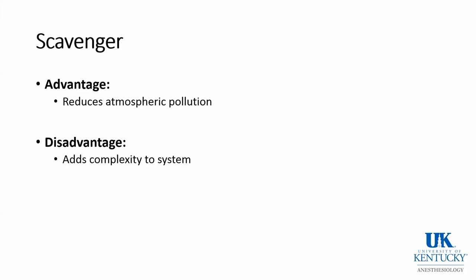I'm not going to discuss the risks of chronic exposure to atmospheric pollutants. However, it's pretty obvious that no one wants to be exposed to anesthetic agents and or nitrous oxide on a chronic basis. So the main advantage of a scavenger is it reduces atmospheric pollution in the operating room, but of course, it discharges the agents into the world. The disadvantage is that it adds complexity to the system.